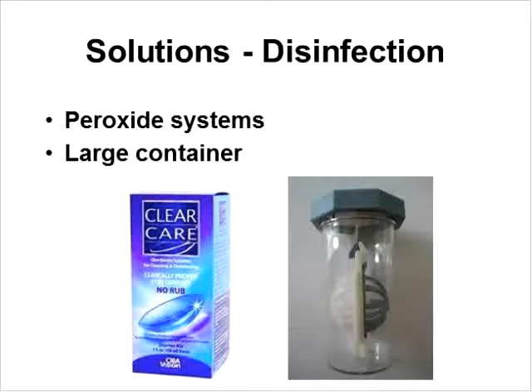I just find that it's helpful in the patients with the very large diameter lenses, but it's not needed for all patients when I use ClearCare. Yeah, most of your screw cap cases, if you get a lens that's over 20 millimeters in diameter, some of the smaller cases like that come in the renewed kit, they're a little bit small for a 20 millimeter contact lens. Okay, here's a question for you.